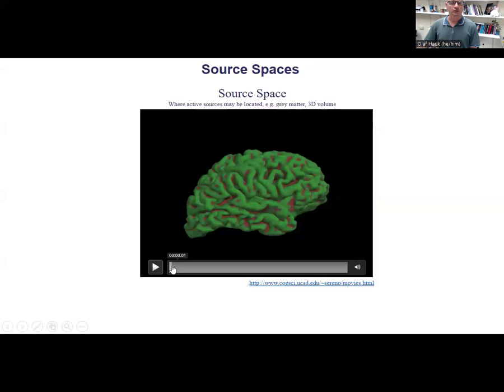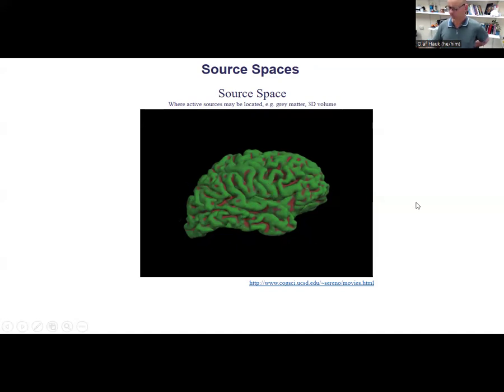So that is quite a powerful way to model EEG and MEG sources, especially since we mostly see the cortical sources. I mean, they're the ones that are closest to the sensors. You can include subcortical sources, a few words on that later, but most of the time, I think we are mostly interested in the cortical sources.